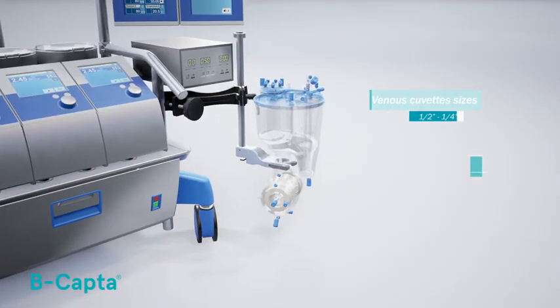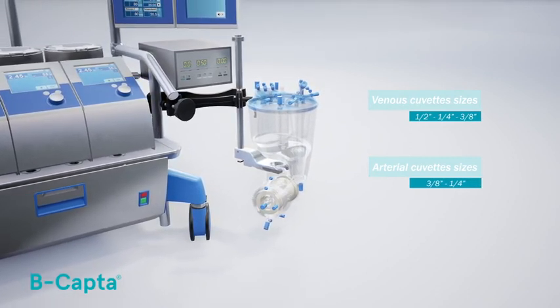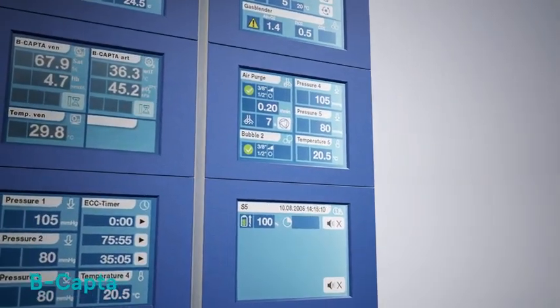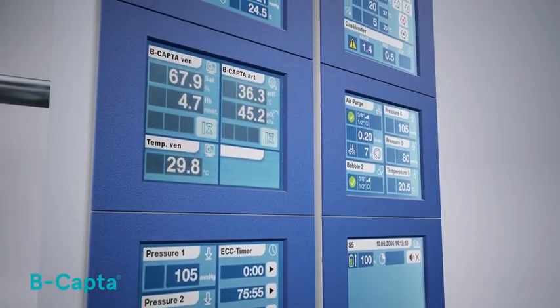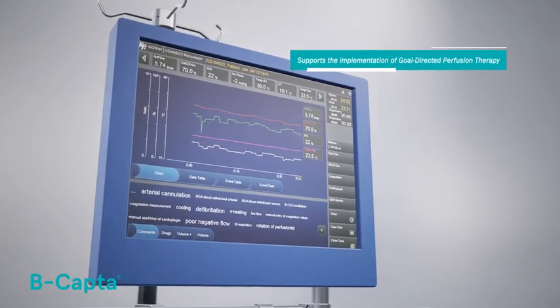Its sensors fit all disposable cuvette sizes for adult and pediatric procedures. The display is integrated in the S5 HLM, allowing the perfusionist to have all parameters in the same location. The BeCaptor values are transferred to Connect, supporting the implementation of goal-directed perfusion therapy.